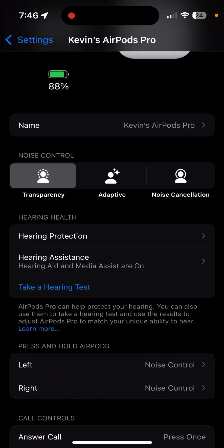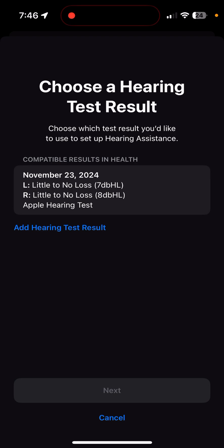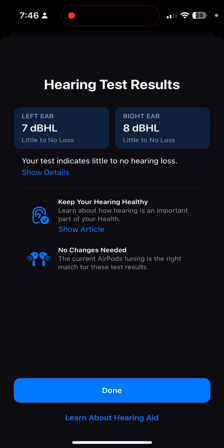If the volume is up and the hearing aids still aren't working, here's a trick. Go into your hearing assistance menu and do 'Update Hearing Test Results.' Choose your latest hearing test and click Next. This is where I believe Apple messed up this menu. Most people incorrectly click Done at this point — that does not enable the hearing aid. As you can see it says 'no changes needed.' To actually get it to turn on, you have to click 'Learn About Hearing Aid' at the bottom.